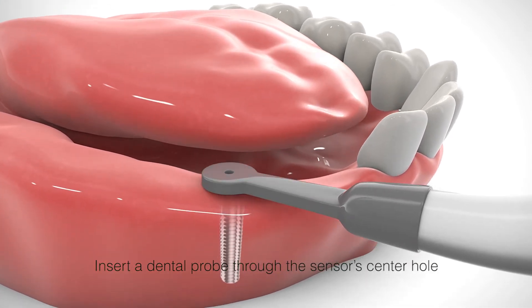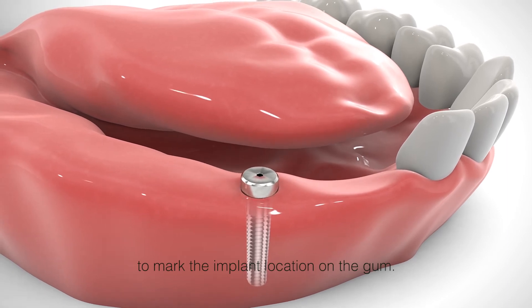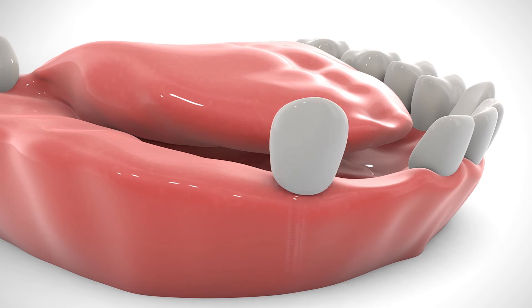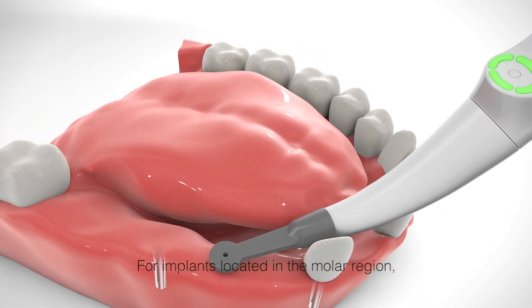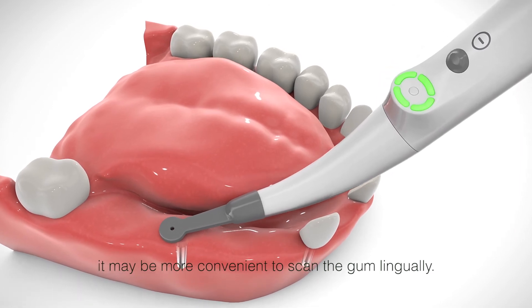Insert a dental probe through the sensor center hole to mark the implant location on the gum. For implants located in the molar region, it may be more convenient to scan the gum lingually.